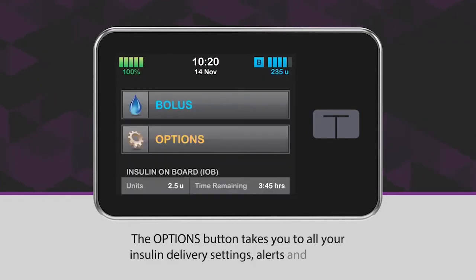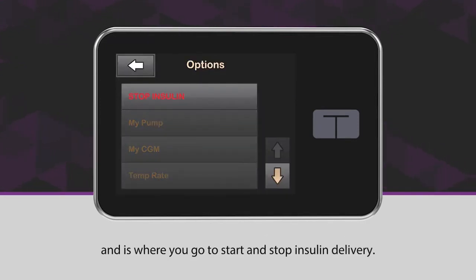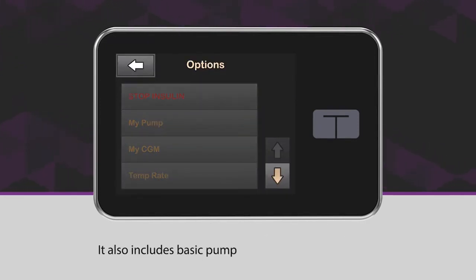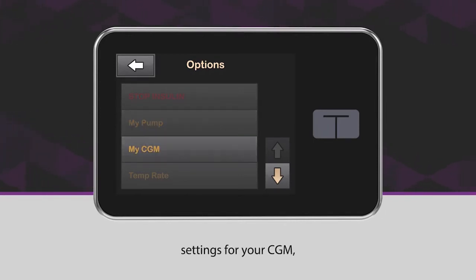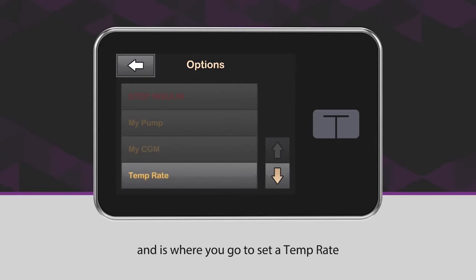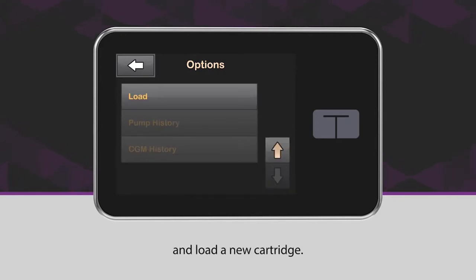The options button takes you to all your insulin delivery settings, alerts and alarms, and is where you go to start and stop insulin delivery. It also includes basic pump settings like time and date, settings for your CGM, and is where you go to set a temp rate and load a new cartridge.